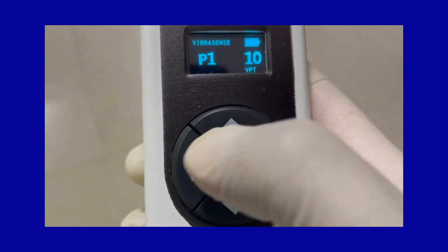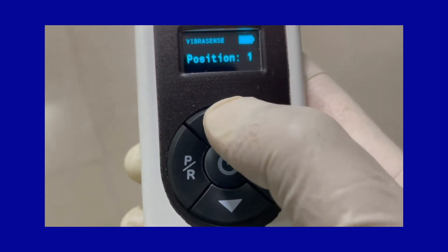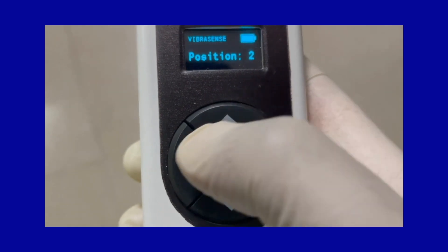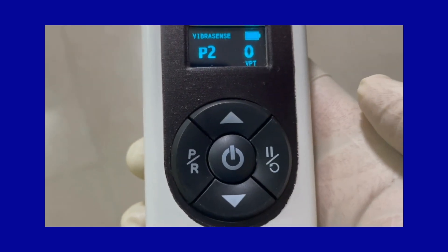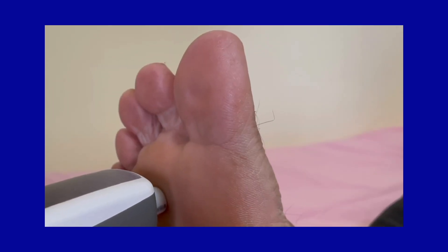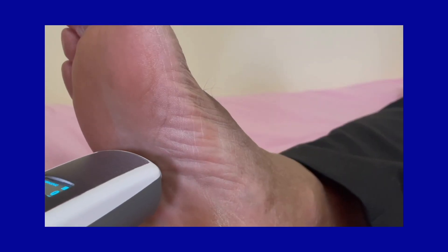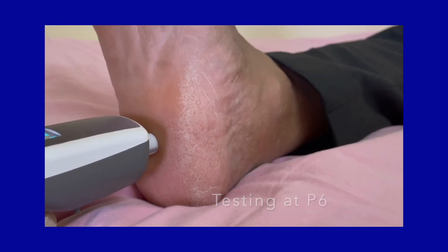Save this value by pressing the peer button once, then use the up arrow to move the position to P2 and save this position by pressing the peer button once. Now proceed to test at position P2. Follow the same steps of testing at the subsequent positions from P2 to P6.